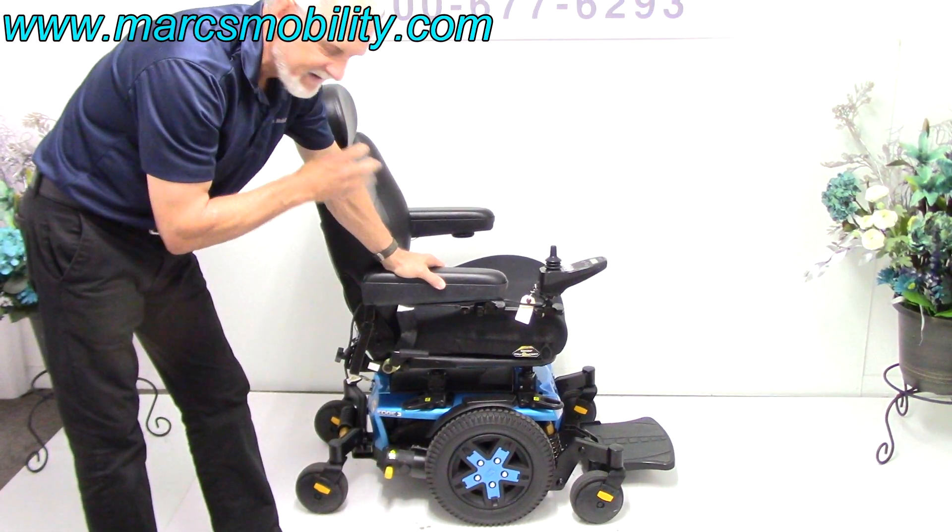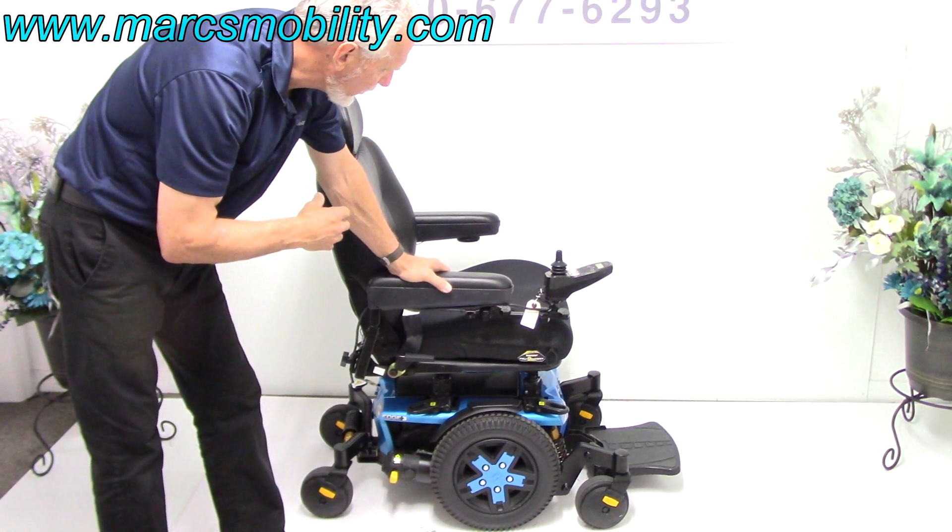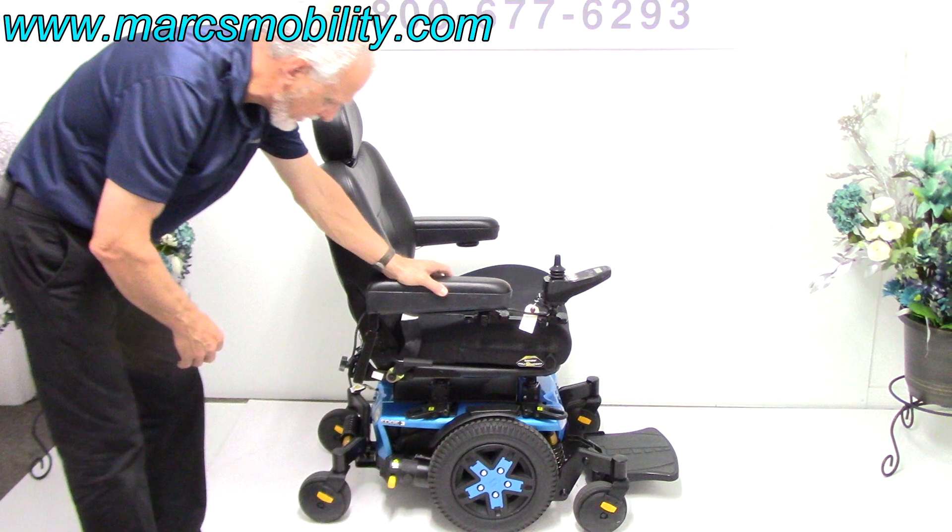It also has lights. It has a captain seat. So it's a gorgeous power chair. Let's talk about the base first.